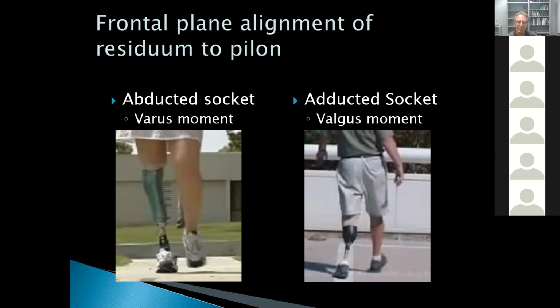But what's important for gait is that instead of bringing the base of support, which is the prosthetic foot, underneath the center of mass, it's taking that prosthetic foot farther away from the center of mass.